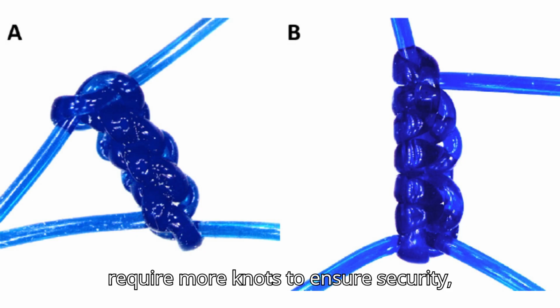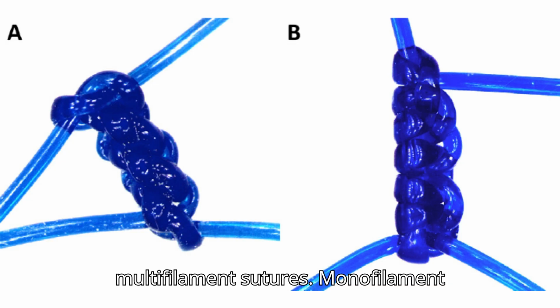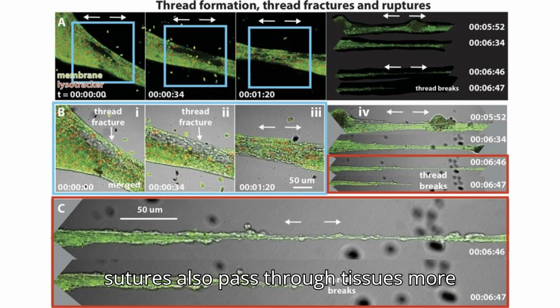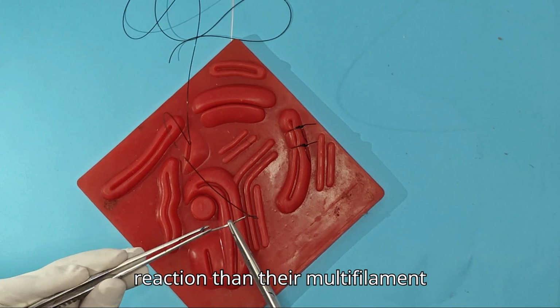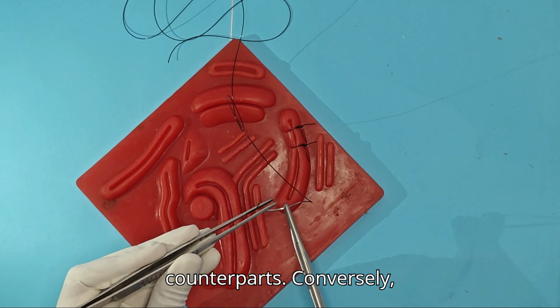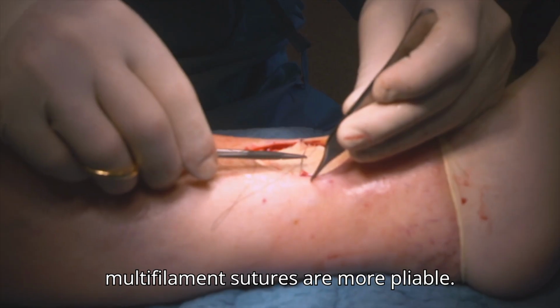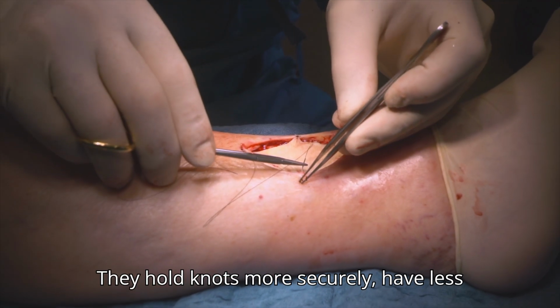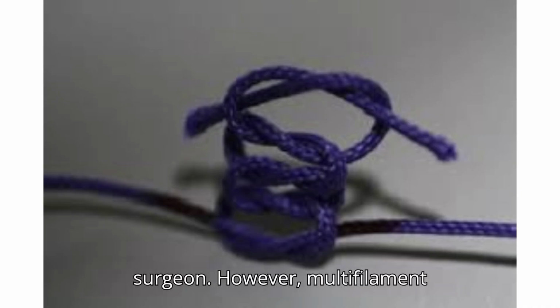They typically require more knots to ensure security, but tend to fracture less than multifilament sutures. Monofilament sutures also pass through tissues more easily and cause a less inflammatory reaction than their multifilament counterparts. Conversely, multifilament sutures are more pliable. They hold knots more securely, have less memory, and are easier to handle by the surgeon.